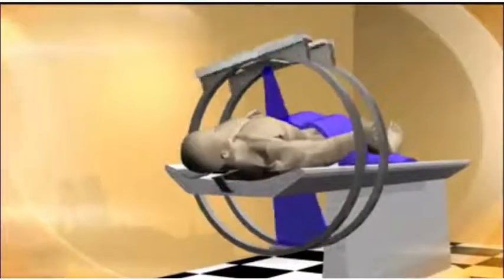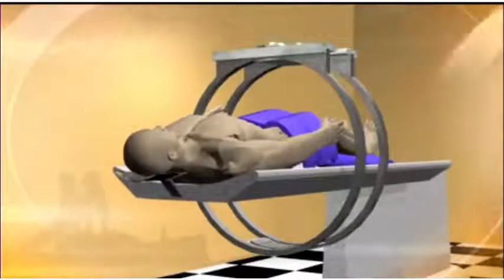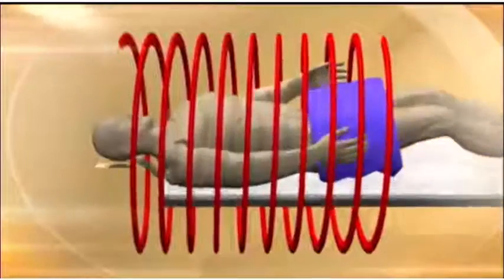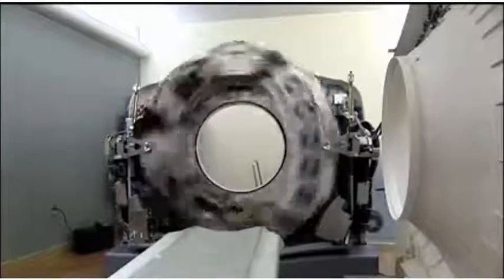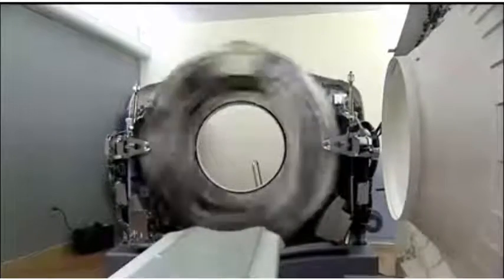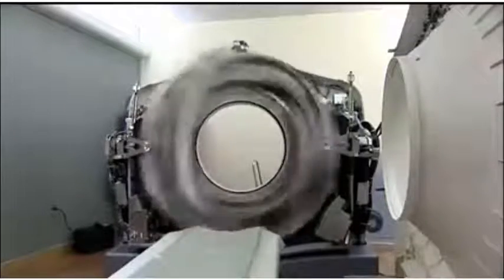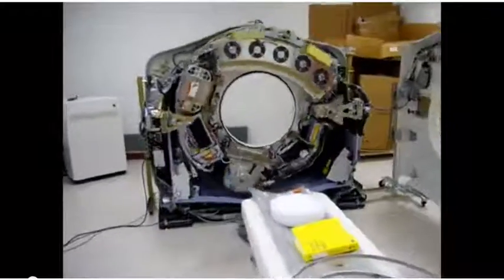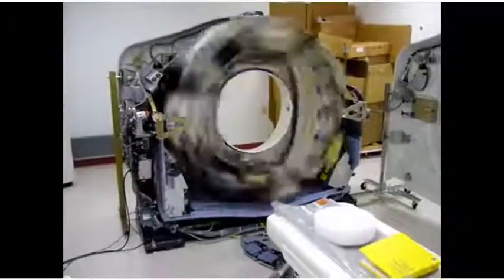This is mainly because when you have the gantry and the X-ray and the detector spinning and they do a 360 movement, they use a lot more processing. The time for helicoidal movement, in contrast to 360 movement, is very, very fast and very easy to process, and also the data of helicoidal movement is much less, and the space and the format and everything is a little more efficient than the 360 way.